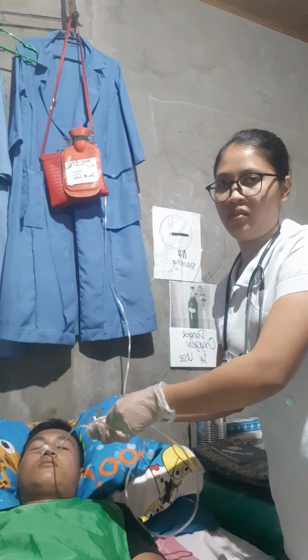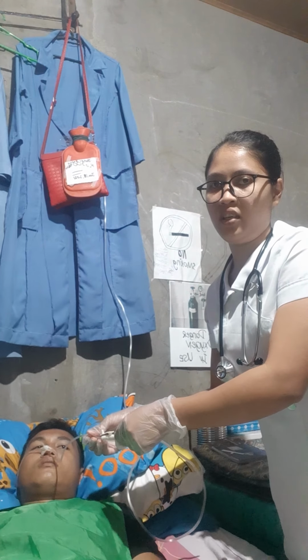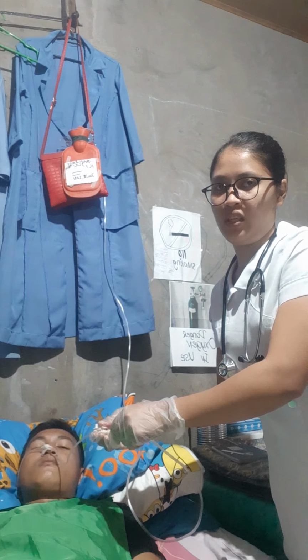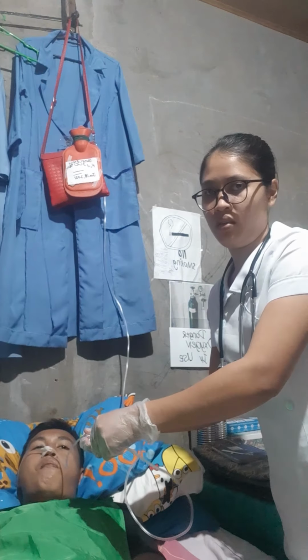Pre-filled bottle with drip, the closed system. So we need to remove the screw-up cap from the container and attach the administration set with the drip chamber and tubing.